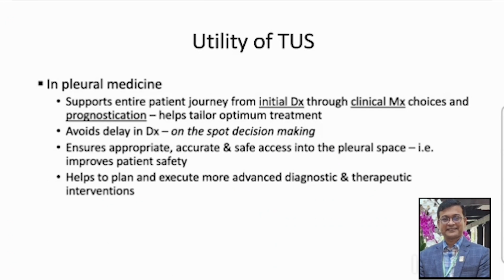So in pleural medicine, it supports the entire patient journey from the initial diagnosis to management and prognostication. It avoids delay in the diagnosis. We can take a spot decision for the diagnosis and what to do next. It makes the journey easier to plan and execute more advanced diagnostic and therapeutic interventions.